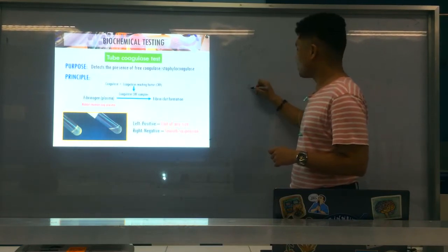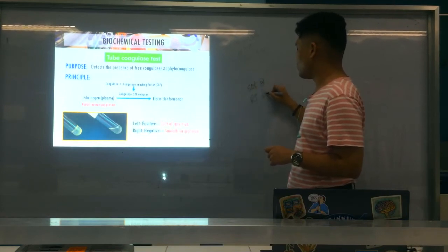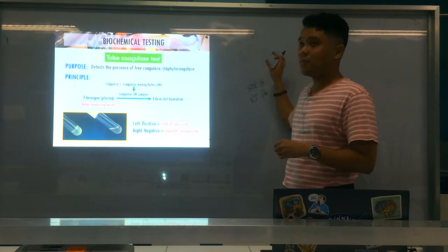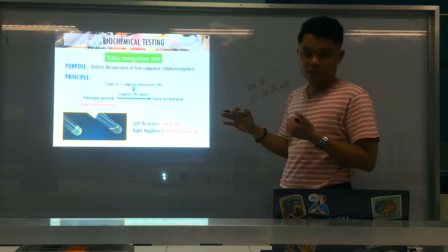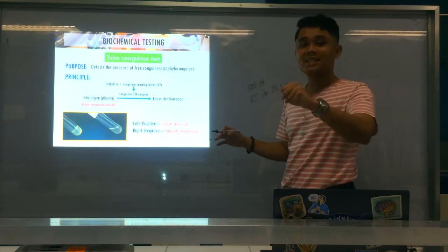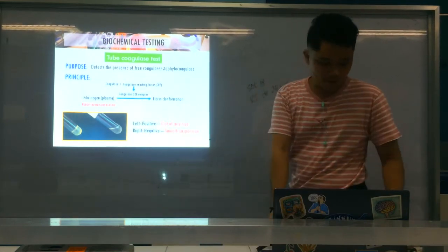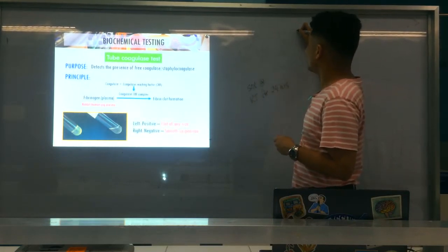Alright. So, kuwaon ni siya, set at room temp na for 24 hours. Okay? Because pwede kang mahimo, if imo na siyang i-prolong than 4 hours, prolong ang incubation at 37 for more than 4 hours, what happens is, pwedeng ma-false negative, kay ang clot, mulize na siya because of the enzyme, fibrinolysin.